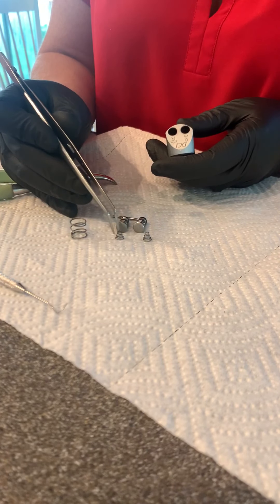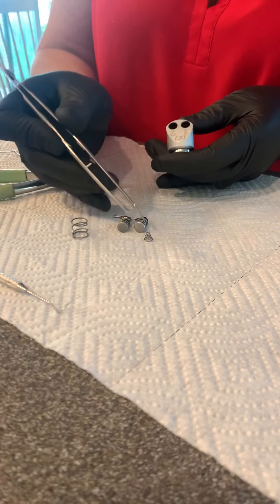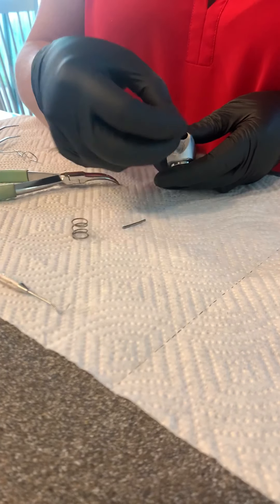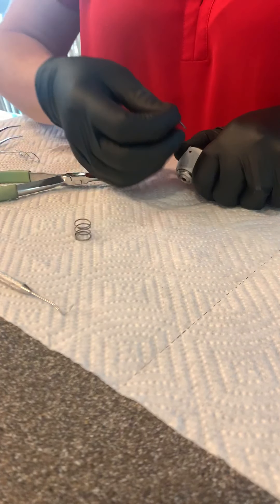Remember when you're replacing your new spring and buttons: Christmas tree up. Put each button back in place, and in order to get that pin back through, depress each button.